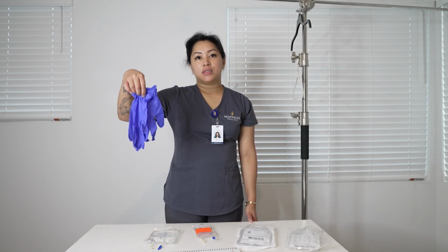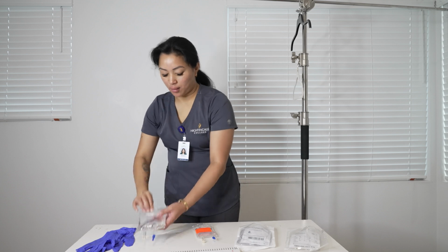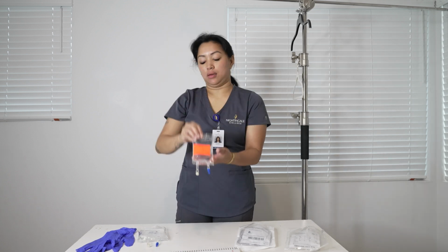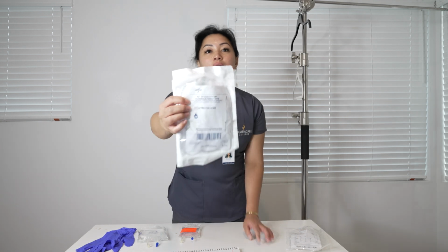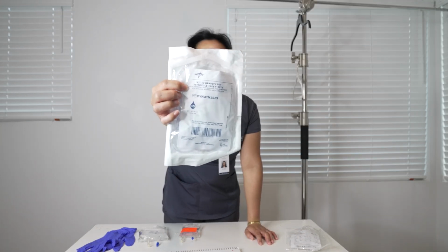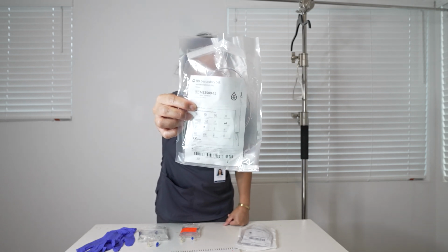I have my gloves, my fluids. I have my amoxicillin. I have alcohol pads. I have my primary tubing, 15 drop factor, and then my secondary tubing.